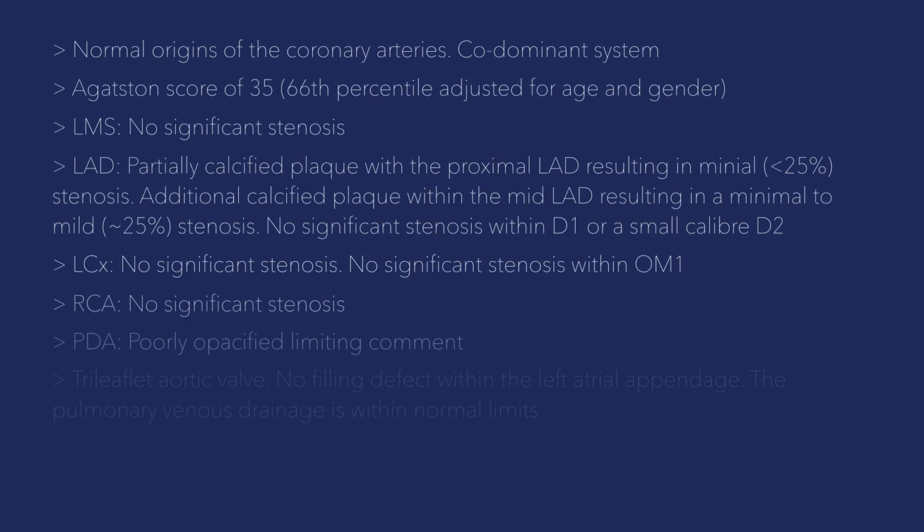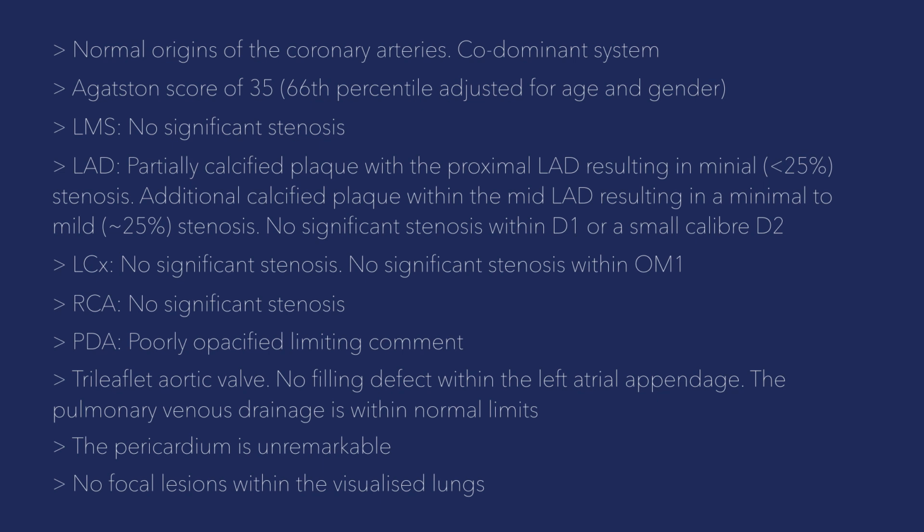There are two parts to the scan. There is the calcium score, and I must say as a cardiologist I don't use just the calcium score. It used to be used when the whole radiation dose for the full scan was much higher. But the calcium score is a number like the cholesterol level. So the calcium score below the age of 50 should really be 0. And if you have any degree of calcium, that's unusual.